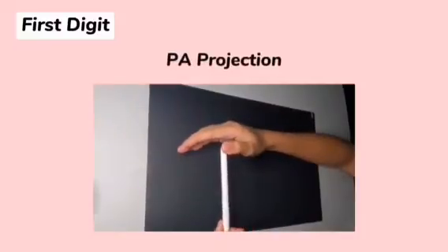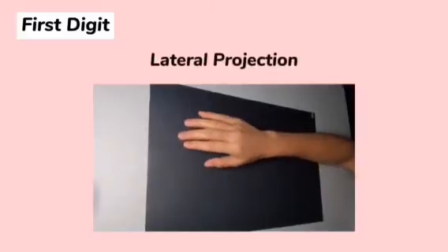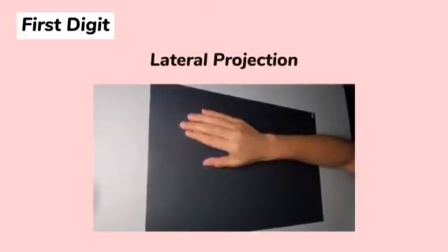Place the hand in the lateral position. Rest the elevated and abducted thumb on a radiographic support or hold it up with a radiolucent stick. Adjust the hand to place the dorsal surface of the digit parallel with the IR. This position magnifies the part. Place the hand in its natural arc position with the palmar surface down and fingers flexed. Adjust the arcing of the hand until a true lateral position of the thumb is obtained.